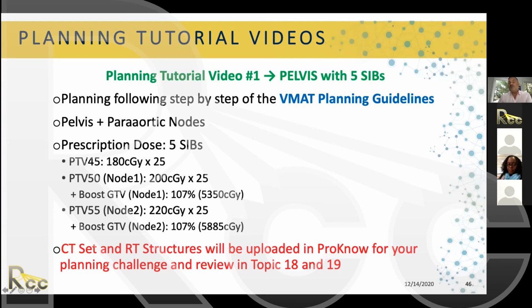We will review it. Basically, you're going to follow this technique that we explained to you, detailed in these VMAT planning guidelines. Everything is there, you can find everything here in the talk. Then you're going to try to reproduce the plan. You're going to have a video where we go through everything. You watch the video first, and then you do your plan. But you can also be creative.